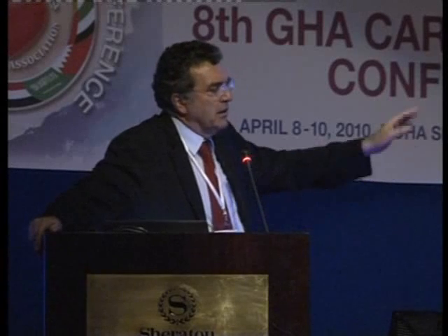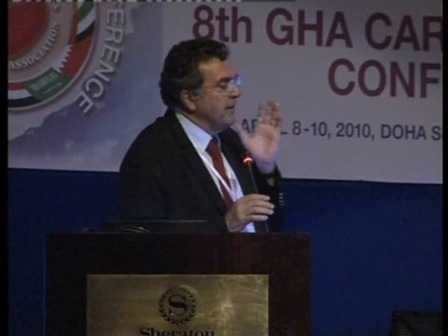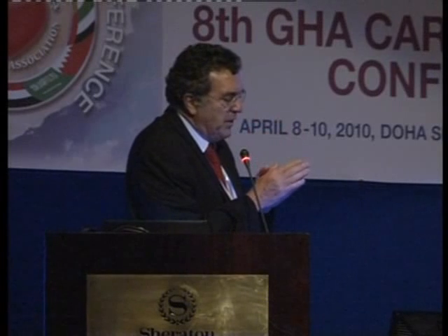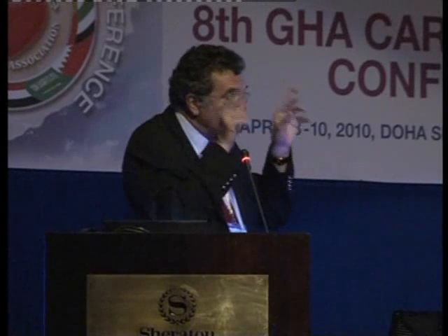The second question: any fallacies of false negative for FFR, for the dose of adenosine, for the vessel, for the wire? What do you think? I think there is a good correlation, and we know since the first studies on FFR that we have a good correlation between the functional evaluation and the clinical outcome.